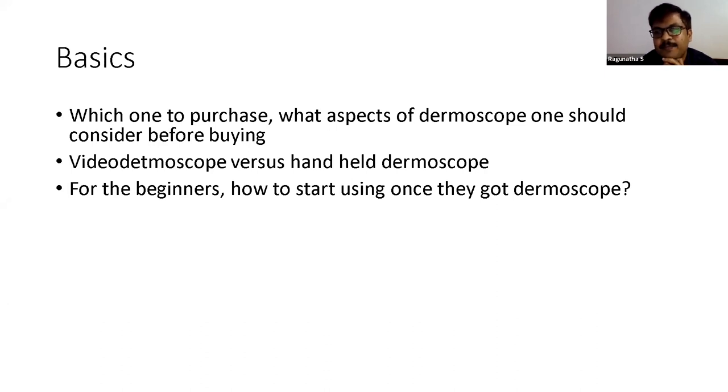Sir, don't laugh if I say this, but I have a lot of moles on my skin. So the first thing I did when I got my handheld dermoscope was to focus it on my own skin. I started learning what the normal patterns on my own skin are, and assessing the different moles that I have. So you can start doing dermoscopy not just on your patients, but on your peers and colleagues, because you need to know what is normal first.